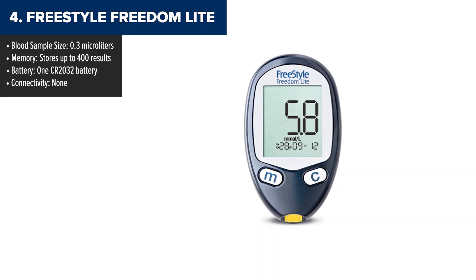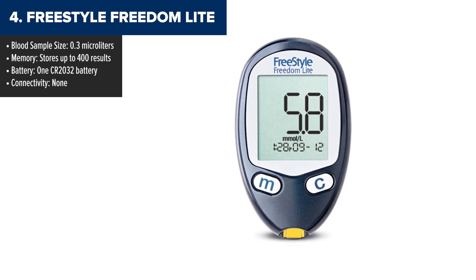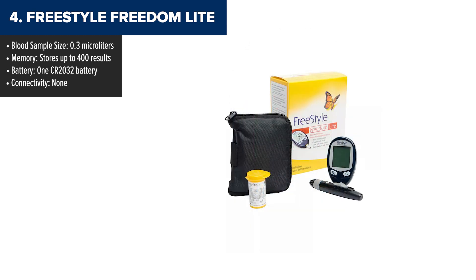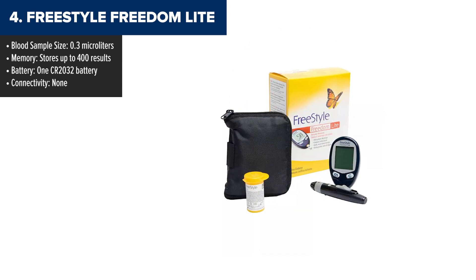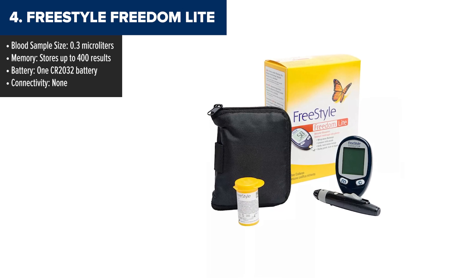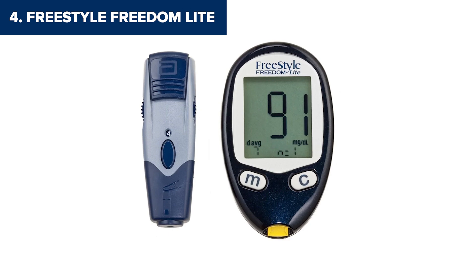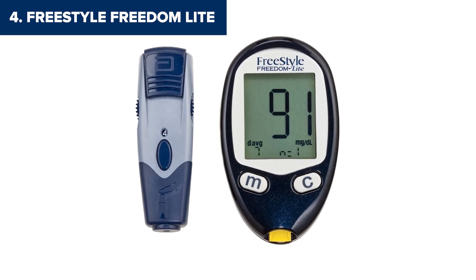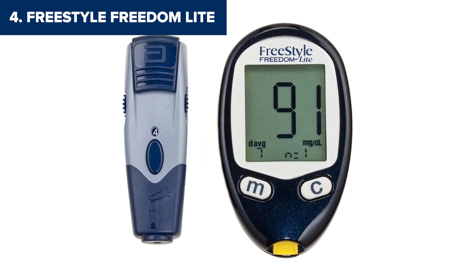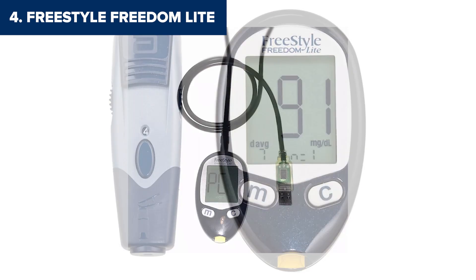At number 4, we've got the Freestyle Freedom Lite. This one is all about simplicity, with a large, easy-to-read display that's perfect for anyone who struggles with smaller screens. It's a classic device that delivers reliable results without over-complicating things. The standout feature here is how little blood it requires — just 0.3 microliters, one of the smallest sample sizes on this list, which is a big win if you're tired of multiple pricks. It's also no-code, meaning you don't have to calibrate the test strips manually. You can just pop in the strip and start testing right away.